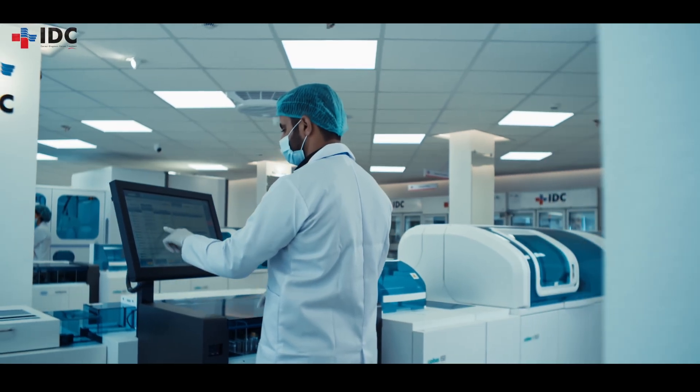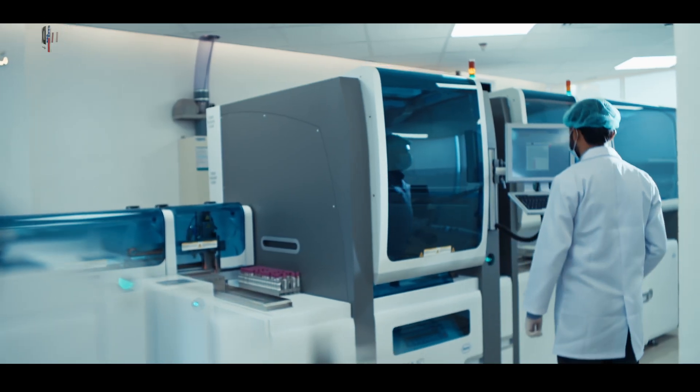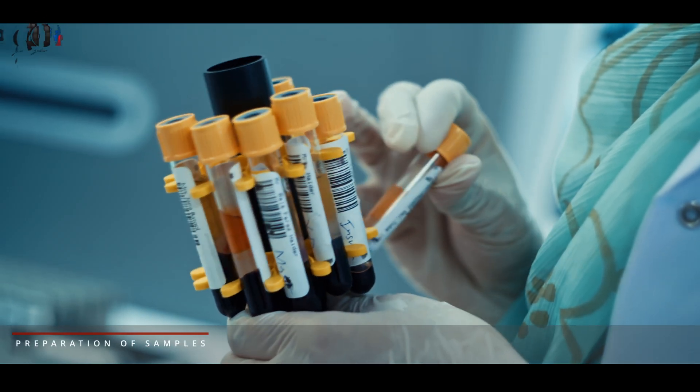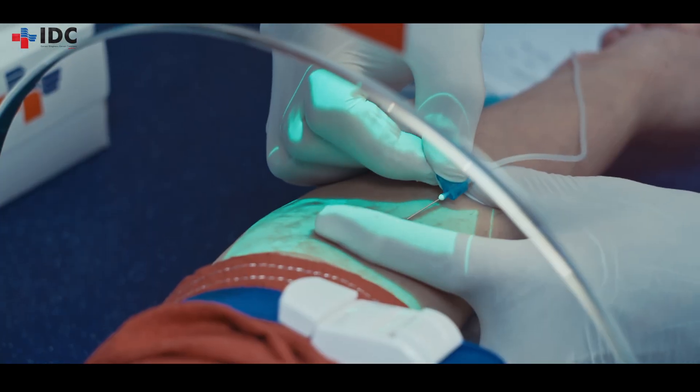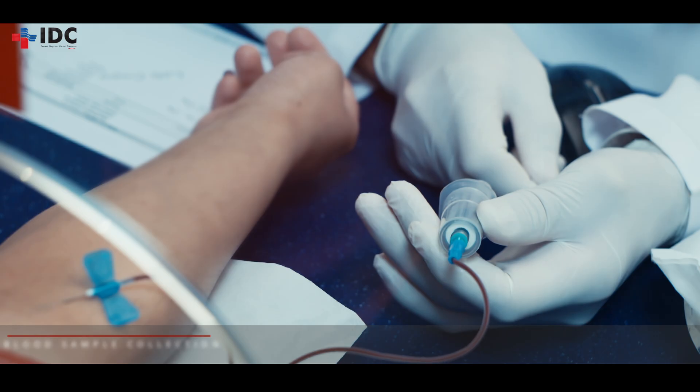Known for its quality and quickest turnaround time, TAT, at affordable cost in medical diagnostics across Pakistan, Islamabad Diagnostic Centre, IDC, believes that precise and timely diagnosis is the key to successful treatment.